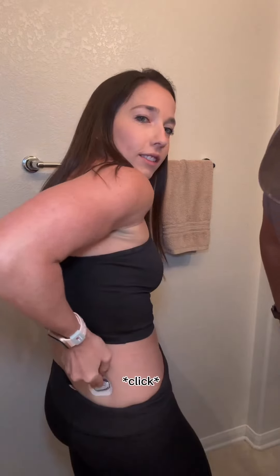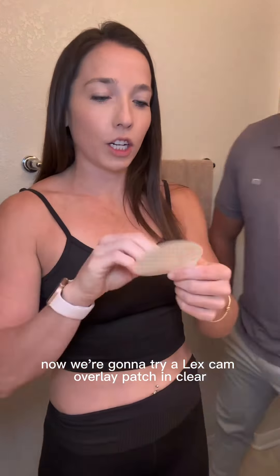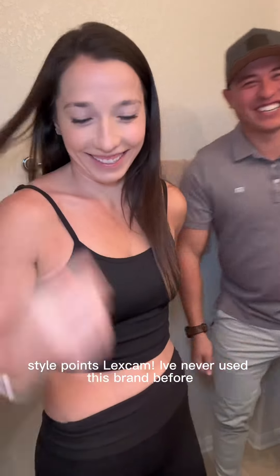Did you just show me? Nice. Alright, now we're going to try a Lexcam overlay patch and clear. It's a little crooked. Style points. Lexcam — we've never used this brand before, so we'll see if it lasts for 10 days.